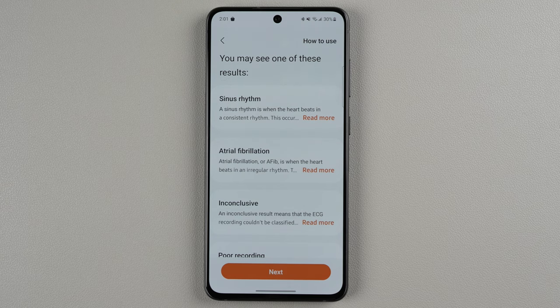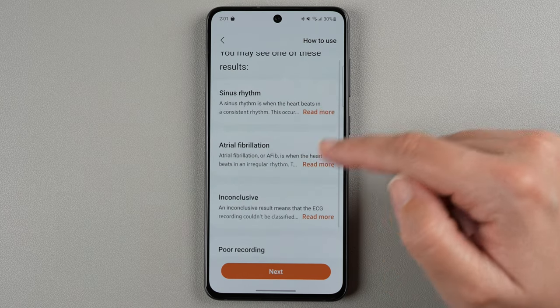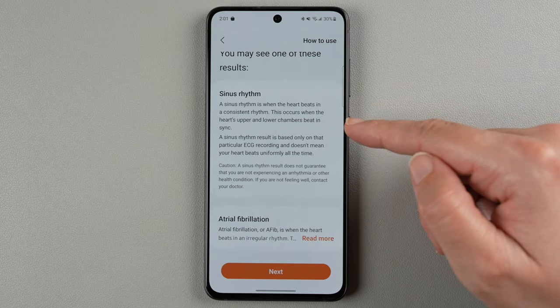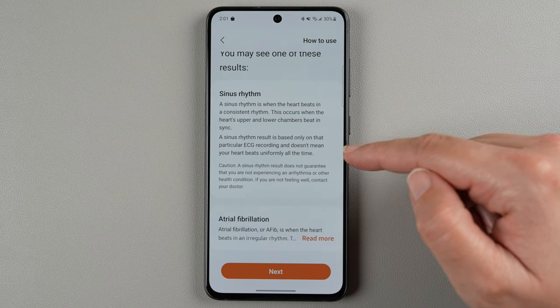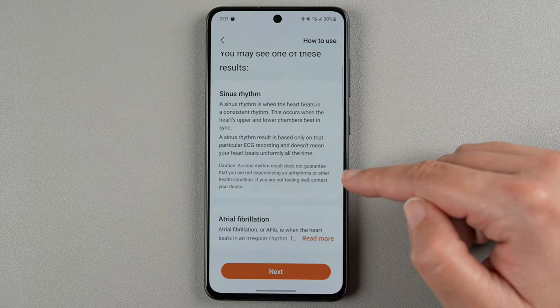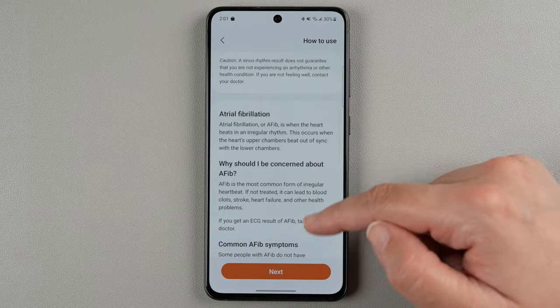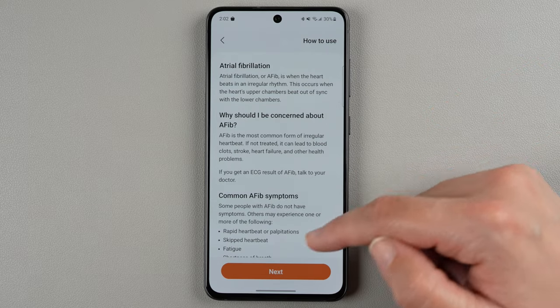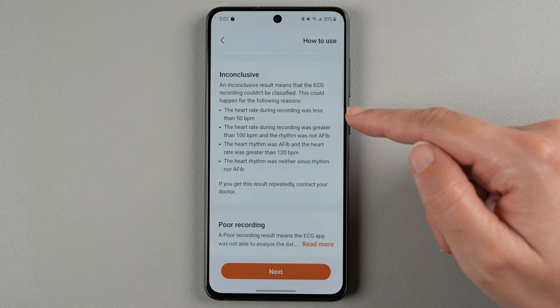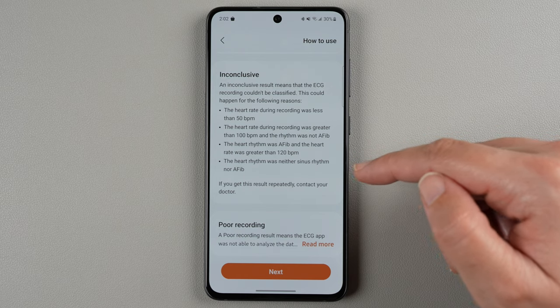You may see one of these results: sinus rhythm, atrial fibrillation, or inconclusive or poor recording. Sinus rhythm is when your heart beats in a consistent rhythm — though it's based on only that particular recording and does not mean your heart beats uniformly all the time. It doesn't guarantee that you're not experiencing arrhythmia or other health conditions, and if you're not feeling well, contact your doctor. It can also tell you if the ECG shows signs of AFib. If it's inconclusive, it could be because your heart rate is too low or too high, or the heart rhythm was neither sinus rhythm nor AFib.